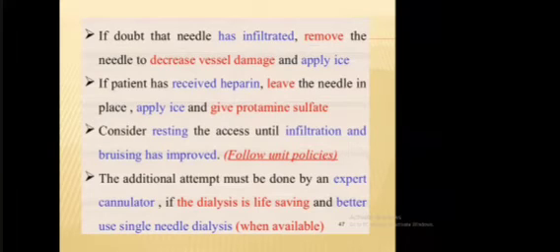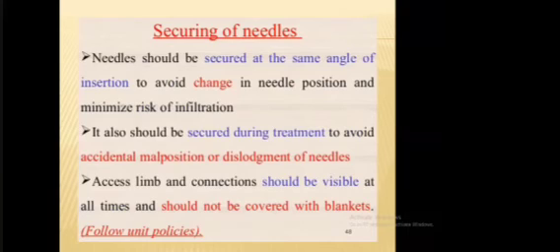If the patient has received heparin, leave the needle in place, apply ice and give protamine sulfate antidote. Consider resting the access until infiltration and bruising have improved. Follow the unit policy, and the additional attempt must be done by an expert cannulator if the dialysis is life-saving, and it is better to use the single needle dialysis technique whenever it's available.